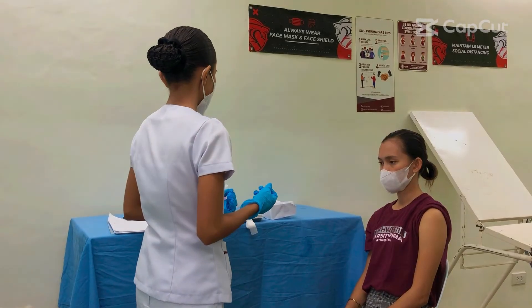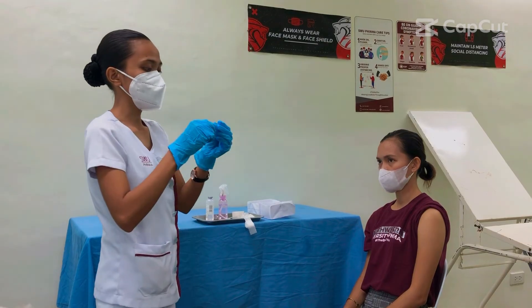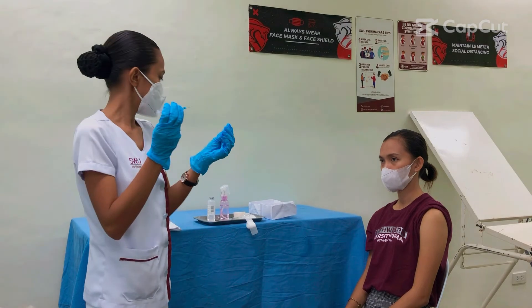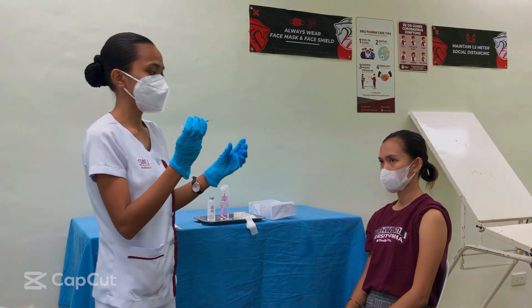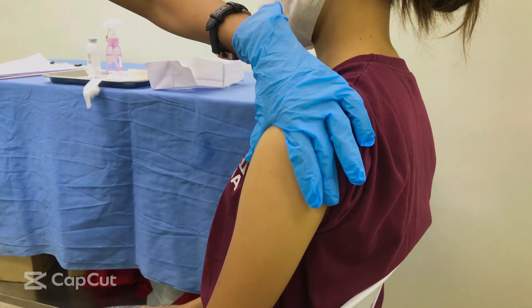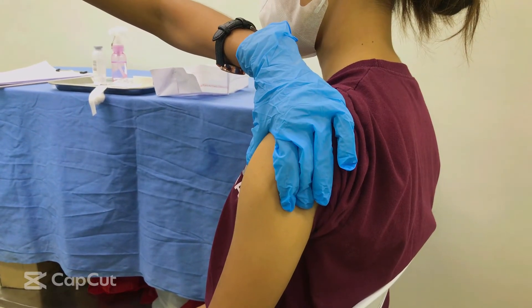Hold the swab or gauze between the third and fourth fingers. Remove the needle cap or sheath from the needle by pulling it straight off. Hold the syringe between the thumb and forefinger of the dominant hand with the palm down.